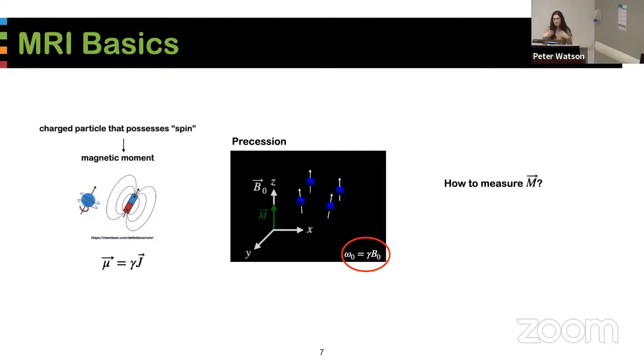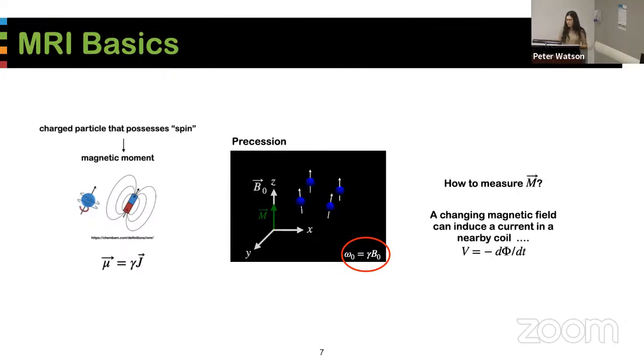So we've put something inside the MRI scanner, and so we've generated some sort of a signal. It's this net magnetization, and we could measure that signal. We want to measure that signal. So the question now is, how do we measure that signal?